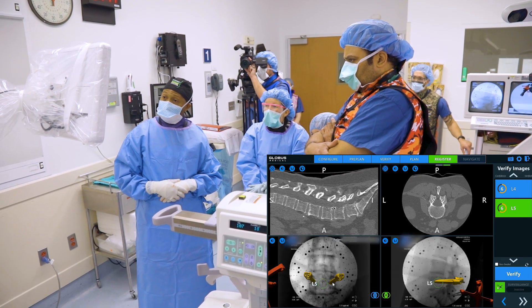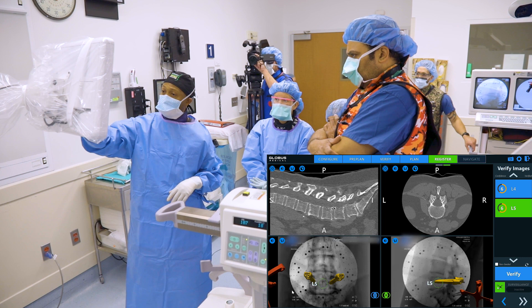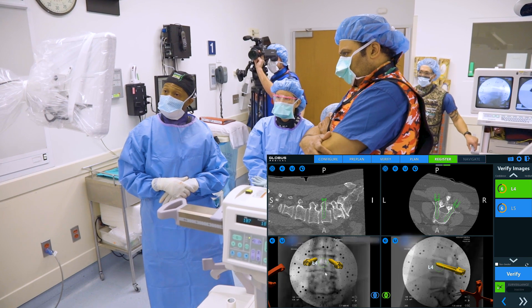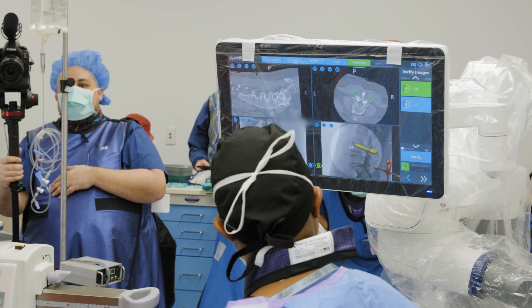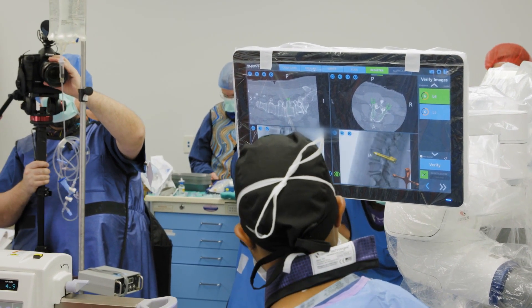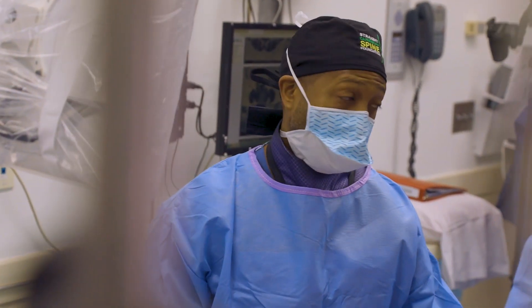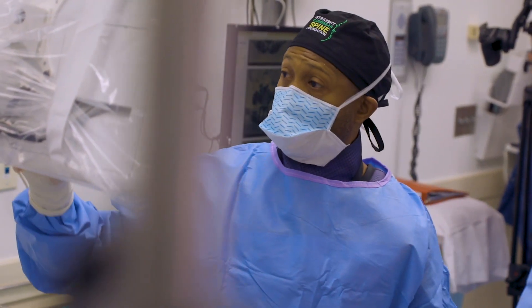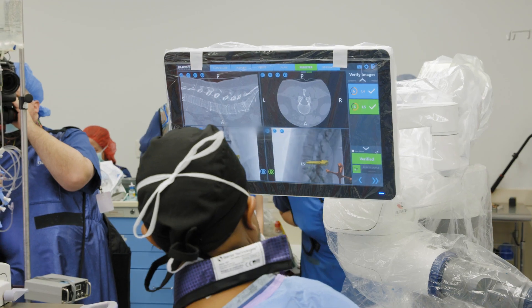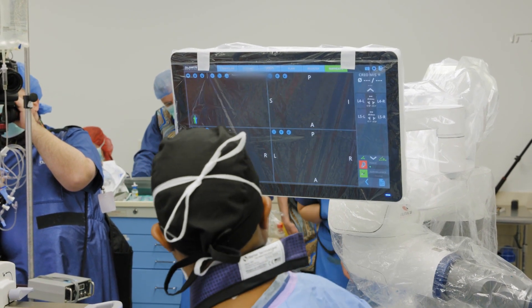We're pretty happy with that. The number six here represents how closely you were merged between the pre-operative CT scan and the intraoperative fluoro — six is a pretty good number. Anywhere from five to ten is typically a successful merge, but again you want to verify the end plates. Once we are happy with the verification at each level, we'll bring the robot into our field.